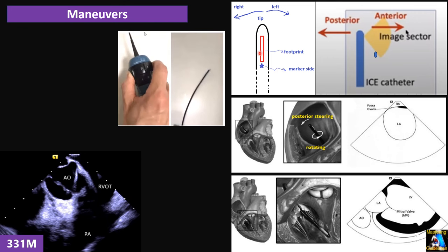The image B shows the movement of the Eustachian ridge and the CTI during flutter and recognizes the anatomical challenges before starting the ablation. Image C corresponds to the same patient once the ablation of the distal aspects of the CTI has started close to the tricuspid valve end of the isthmus.